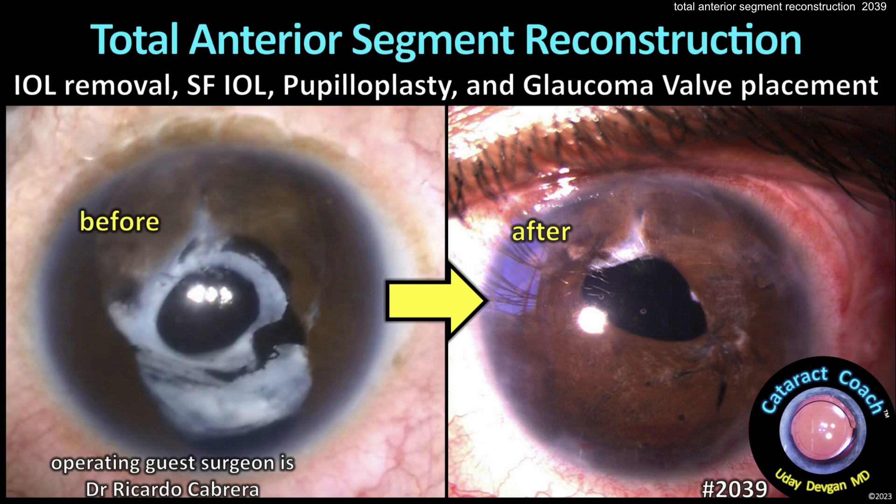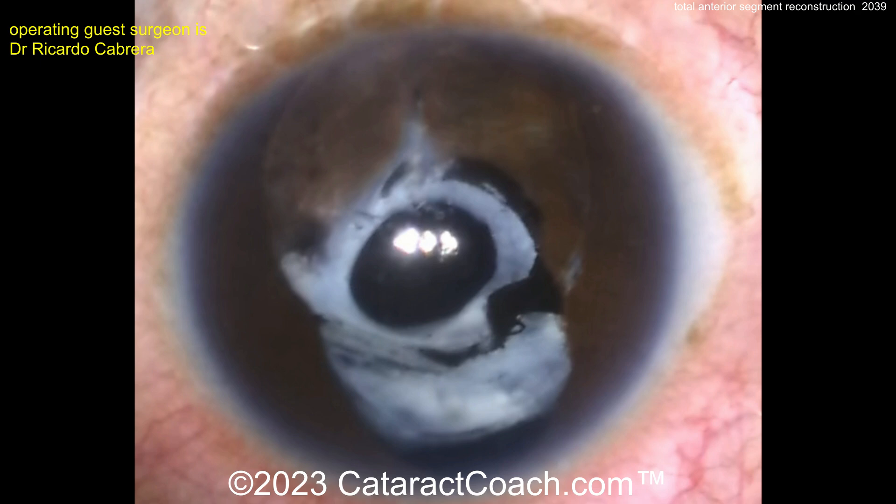CataractCoach.com — total anterior segment reconstruction: IOL removal, scleral fixated IOL, glaucoma valve.